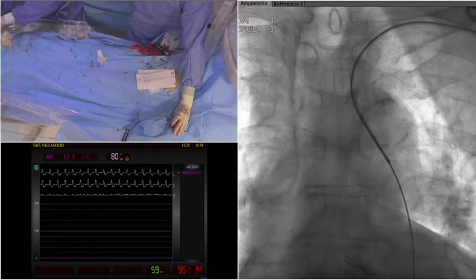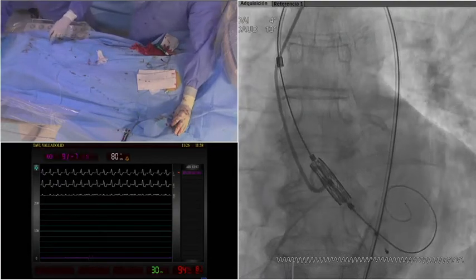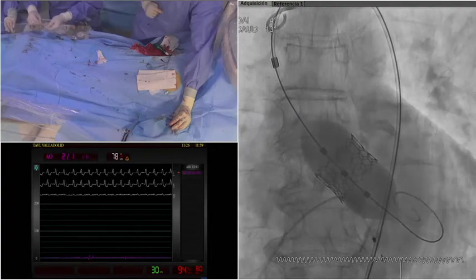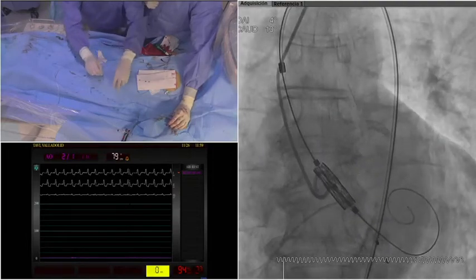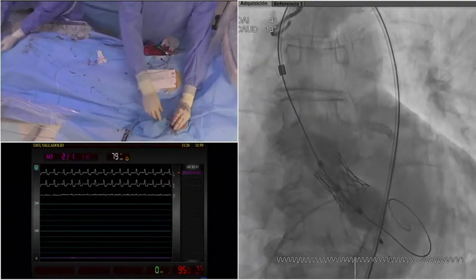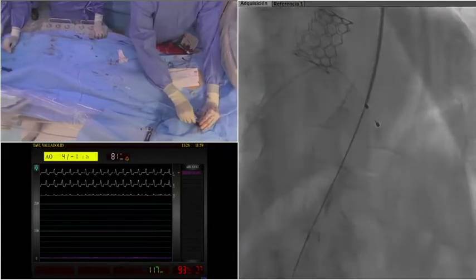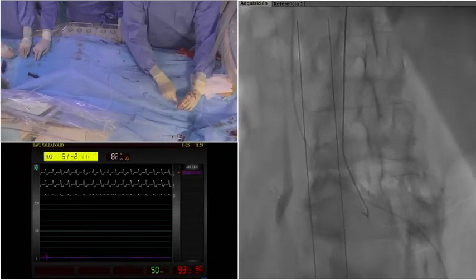Actually, a little bit higher is, I will show you what we tried to do. Can you see in this image the bands, the radiopaque, more clear? Yes, the band, but it seems that the band is below the level of the sinus line. So this was too low. This is what I mean. I tried to reposition it during the inflation, but given the high degree of calcification, I could not move it up anymore. So it was an operator's fault. Well, actually, the positioning is not bad at all, but it could have been placed a little higher by 1 or 2 millimeters. Preparamos el dilatador con otra J.